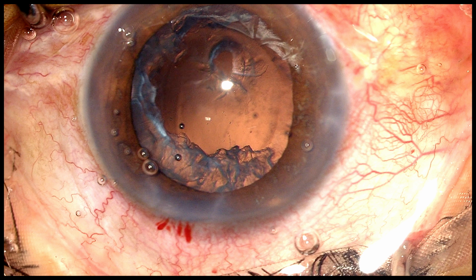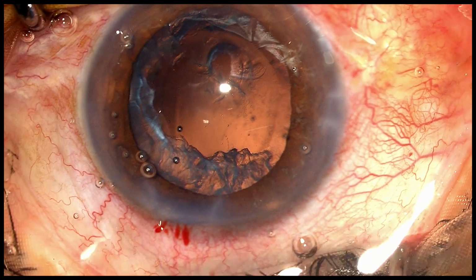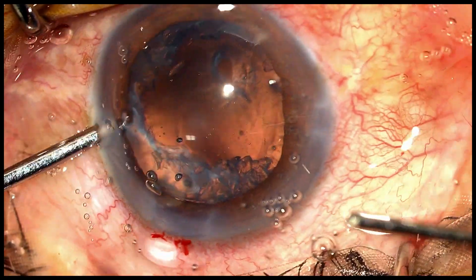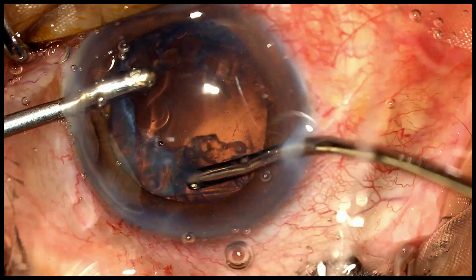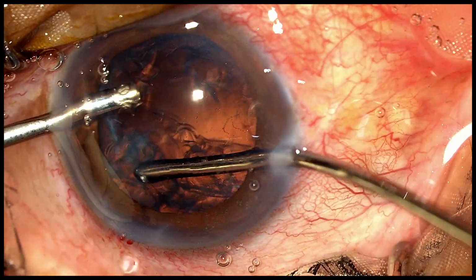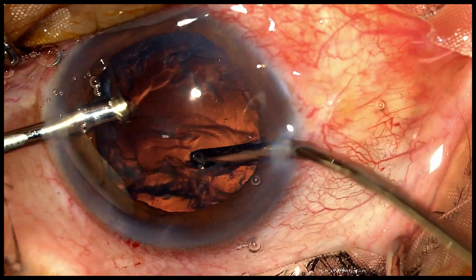Following a viscofluid exchange, both instruments were removed from the eye. And this is the situation we are left with: a tear in the posterior capsule and the entire epinucleus still in place. Let's now see how we managed this case. Some more dispersive viscoelastic was introduced into the anterior chamber to keep the vitreous away, after which I went with the bimanual irrigation aspiration and attempted to remove the epinucleus.